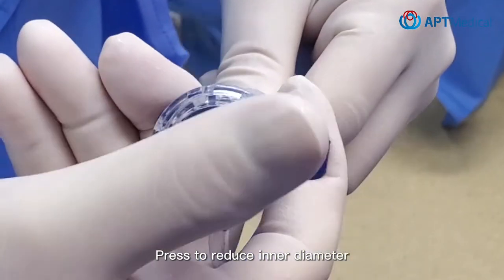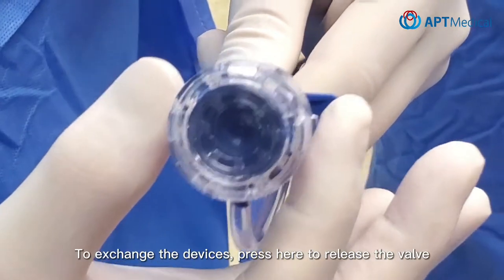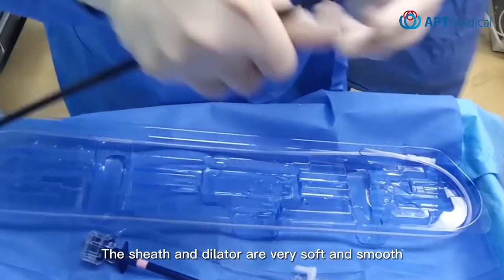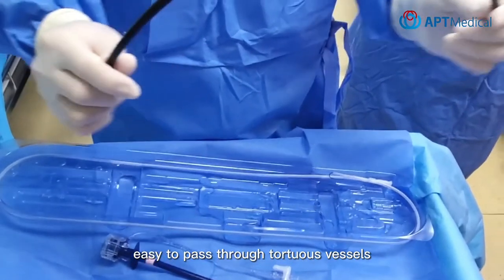Press to reduce inner diameter. Now the valve is closed for hemostasis. To exchange the devices, press here to release the valve. The sheath and dilator are very soft and smooth, easy to pass through tortuous vessels.